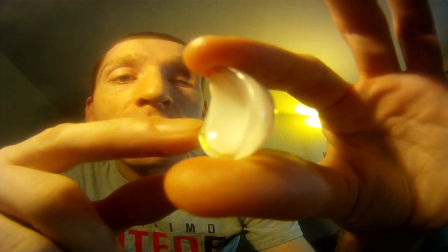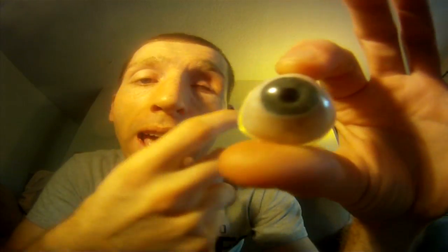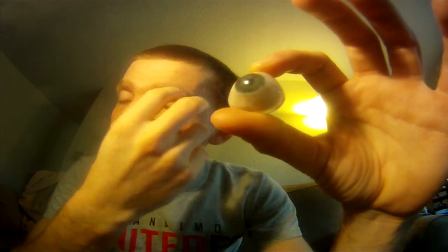You can see the back. It's not a ball. It's concave, but the shape of the back was actually custom built. She took a molding of my eye and, using some sort of gelatin, she poured it in there and it became like a jello thing, and she took it out, and that's how she was able to build the shape of the back of my eye. And that gives me customized comfort, so nothing's poking into my eye in the back or anything like that.